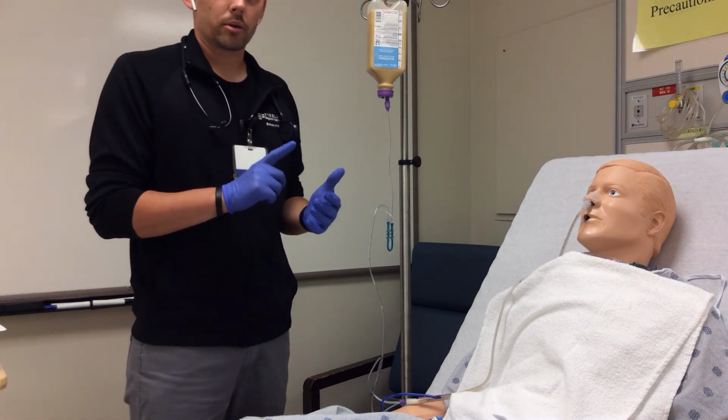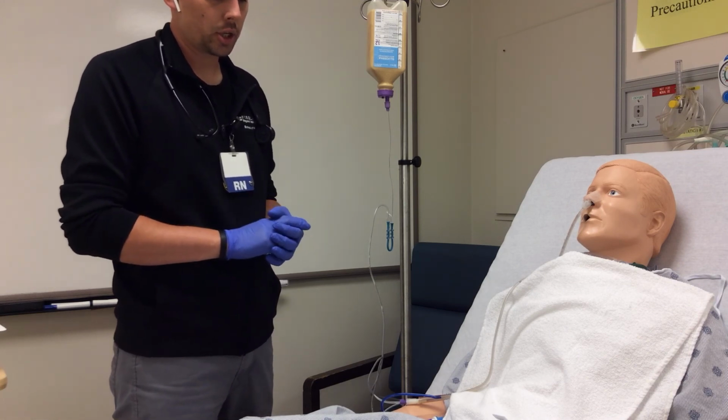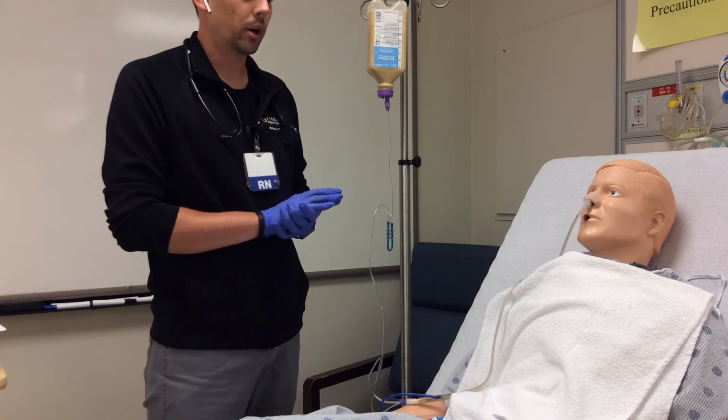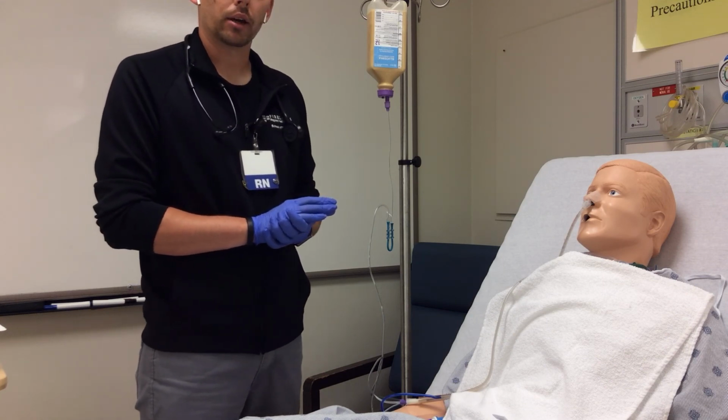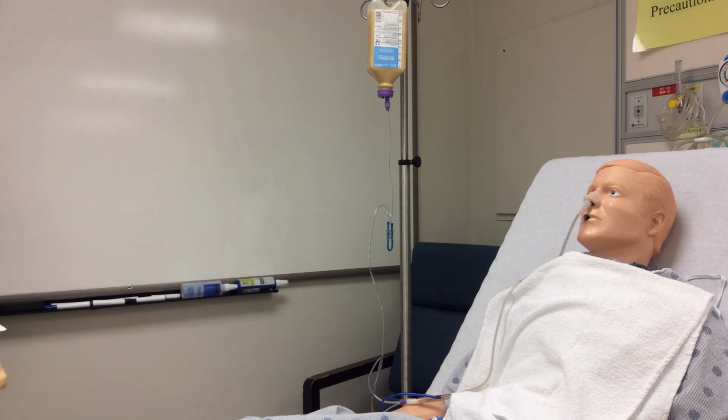So after that, we want to make sure we're documenting our procedure. We are returning the patient's bed to its lowest position, performing hand hygiene, removing our gloves, and then documenting all of our patient care in the Meditech system. So that concludes our continuous tube feed video.